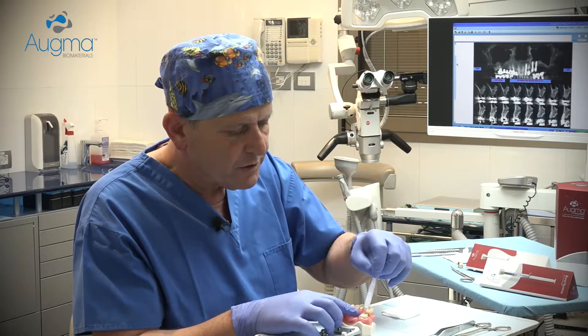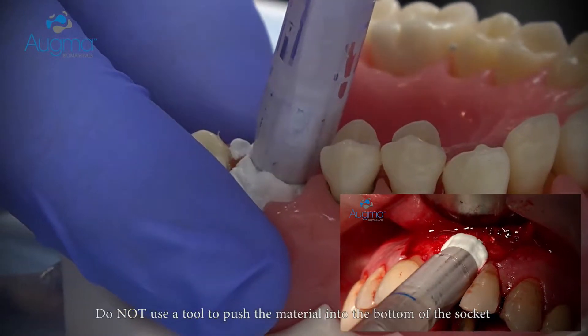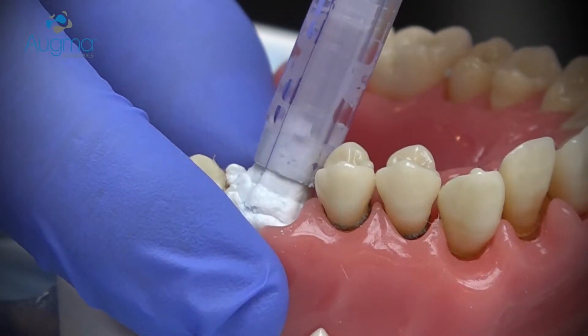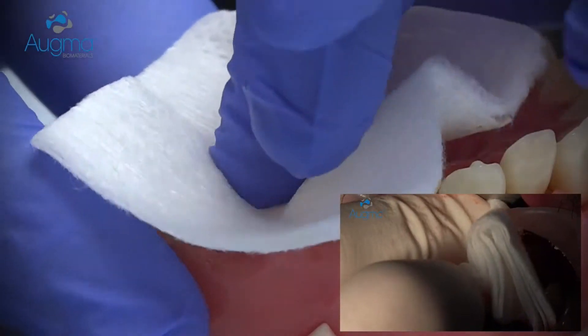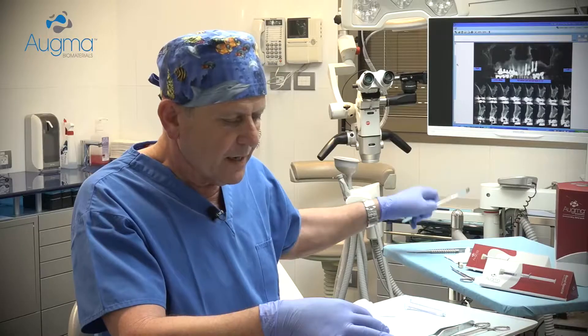Approach to the socket side and eject the material into the socket. Slightly overfill it.